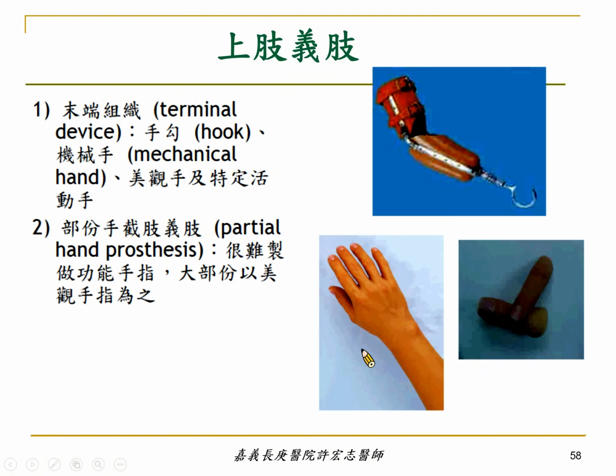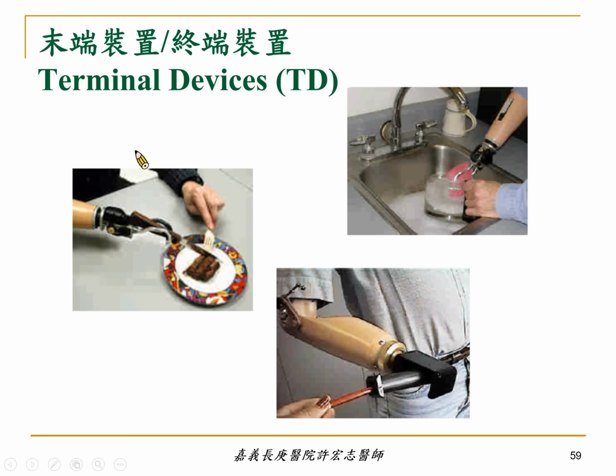Or a mechanical hand like this, or a cosmetic hand like this. You can see the cosmetic hand looks very similar to the natural one.